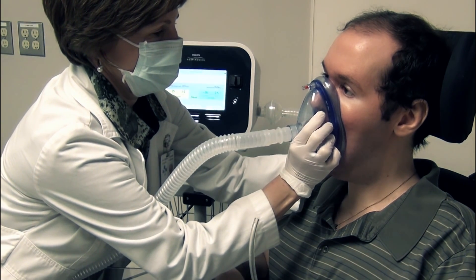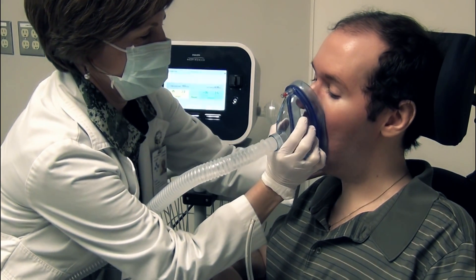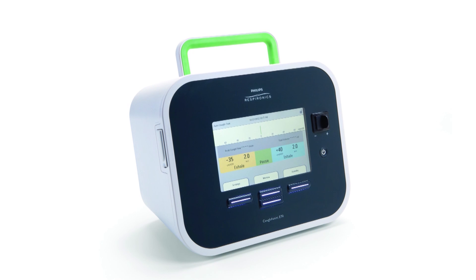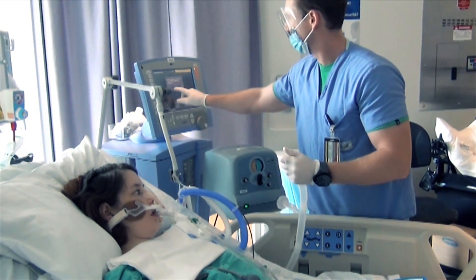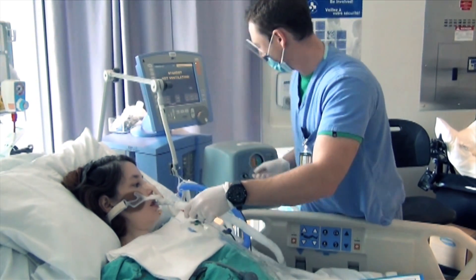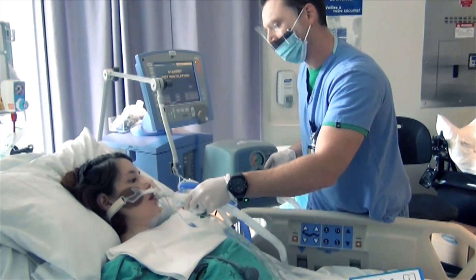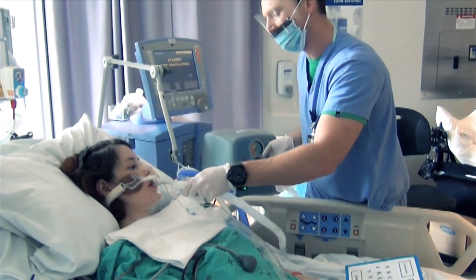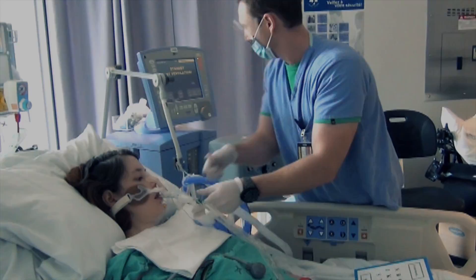This therapy is especially helpful when applied routinely to remove lung secretions, reducing the risk of infection. The MIE applies positive pressure by mask, mouthpiece, or artificial airway connector, inflating both lungs evenly. Positive pressure is followed by a rapid shift to negative pressure to generate consistent peak cough flow of 300 to 600 litres per minute. The usual treatment pressures are plus 40 and minus 40 cm of water pressure. Studies have shown that the minimal effective therapeutic pressures are plus 30 and minus 30 cm of water pressure.